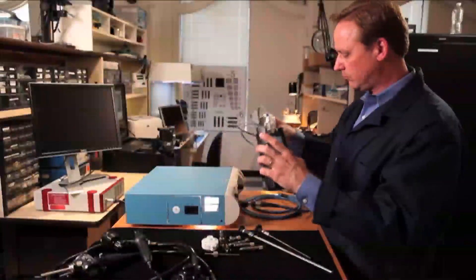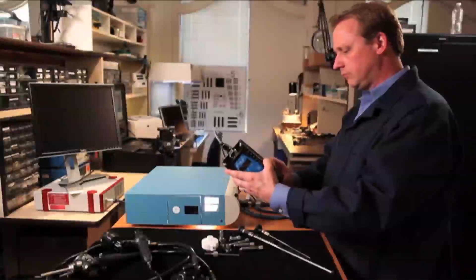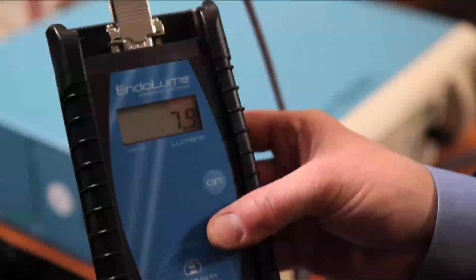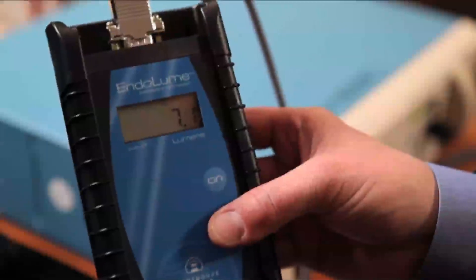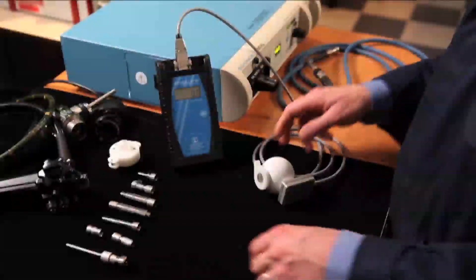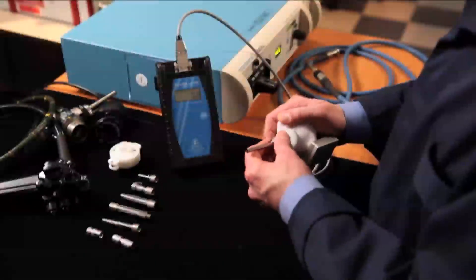Using the Endolume quantifies the amount of illumination at each step in the system. The Endolume is an easy-to-use device with a single button to turn on the device and run a test. The Endolume is a simple and intuitive tool to operate.